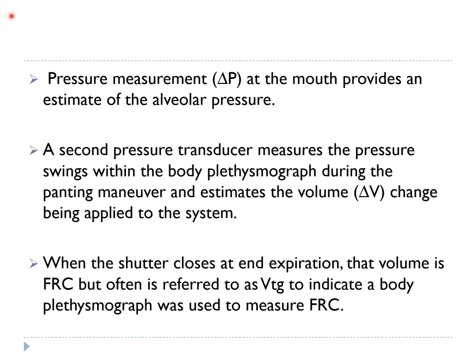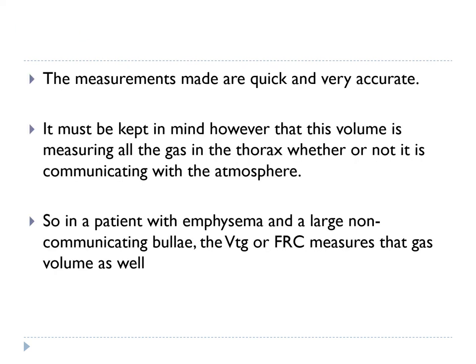When the shutter closes at end expiration, that volume is the FRC, but it is often referred to as the VTG to indicate a body plethysmograph was used to measure the FRC. The measurements made are quick and very accurate. It must be kept in mind that this volume measures all the gas in the thorax, whether or not it is communicating with the atmosphere. So in a patient with emphysema and large non-communicating bullae, the VTG or FRC measures that gas volume.